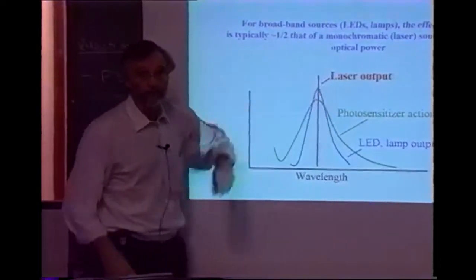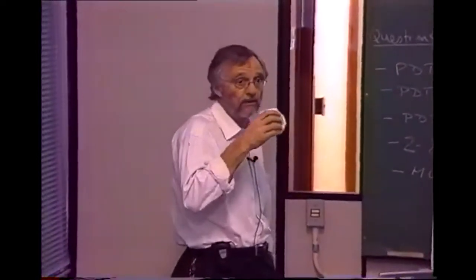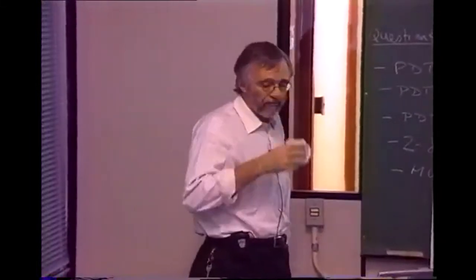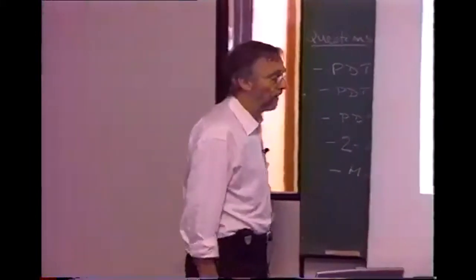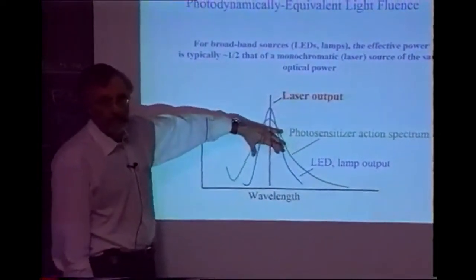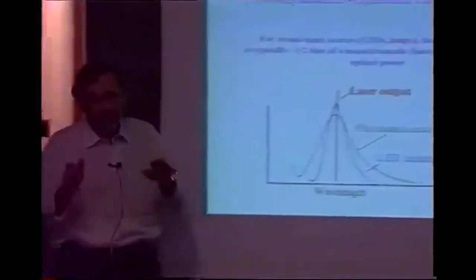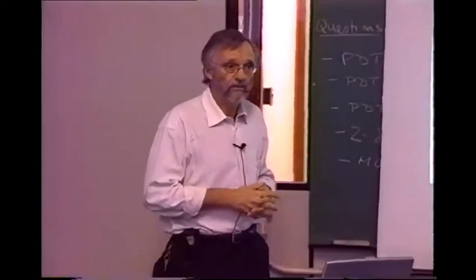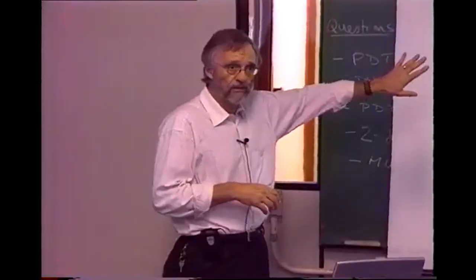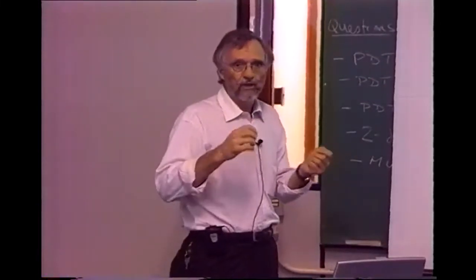We use these new LEDs which are narrow. Yeah. The narrower it is, the better. Yeah. It's only like 10 to 15 nanometers. Yeah. So the commonly available LEDs at say 25 nanometers have about 50%. You know, it may be 30% or 20%, but you have to adjust. You cannot just use the same power and assume that it will work in the same way.